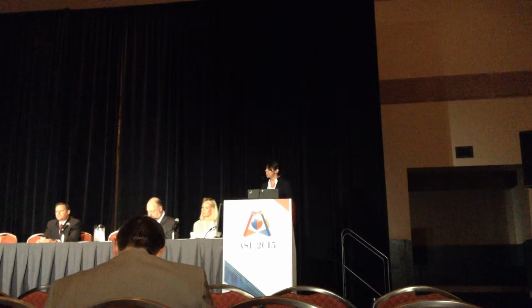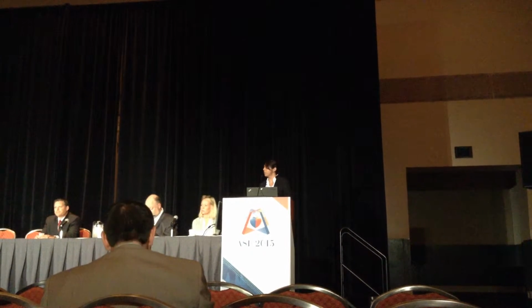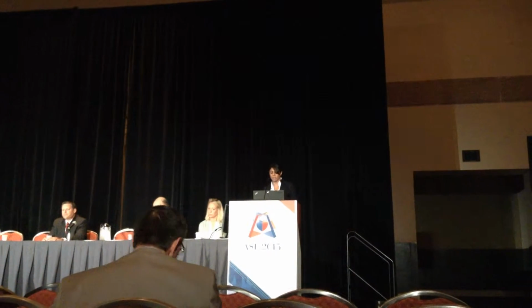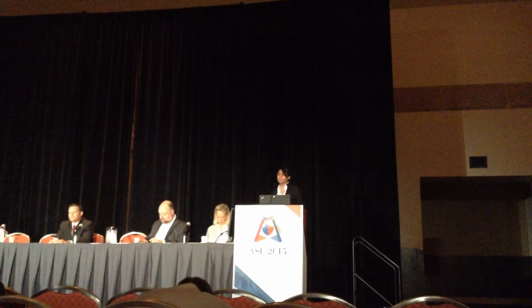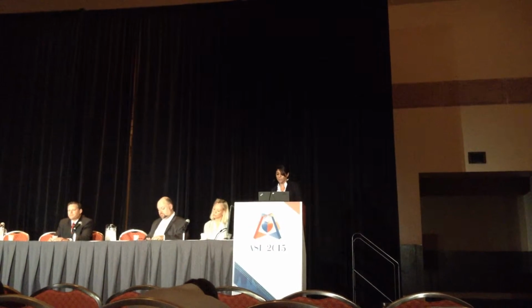So what are the caveats? Well, if there's excessive gain, this may underestimate your valve area. It's better to zoom in for better delineation. So you can see here, there's an unzoomed image where you get a planimetry of 1.4 centimetres squared, and then with a zoomed image, it's 1.3 centimetres squared. So this would be the difference between mild to moderate mitral stenosis or moderate to severe mitral stenosis.